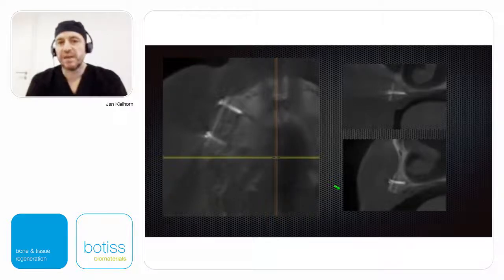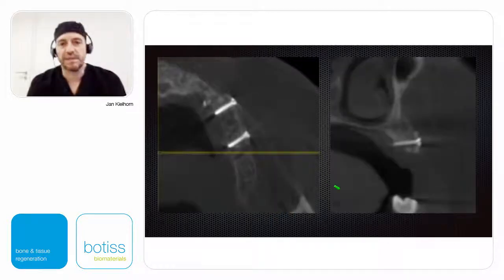And that's why we don't decorticalize the bone before we do augmentation, like some schools recommend, and we will not perforate the cortical bone for nutrition or else. We just leave it like that, as we learned it from the Khoury technique, and this really works, as you see. Otherwise, there's no reason why the cortical line should slowly disappear.